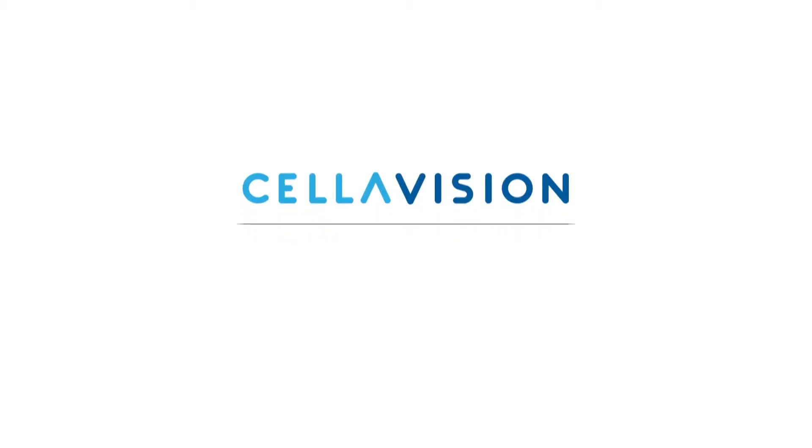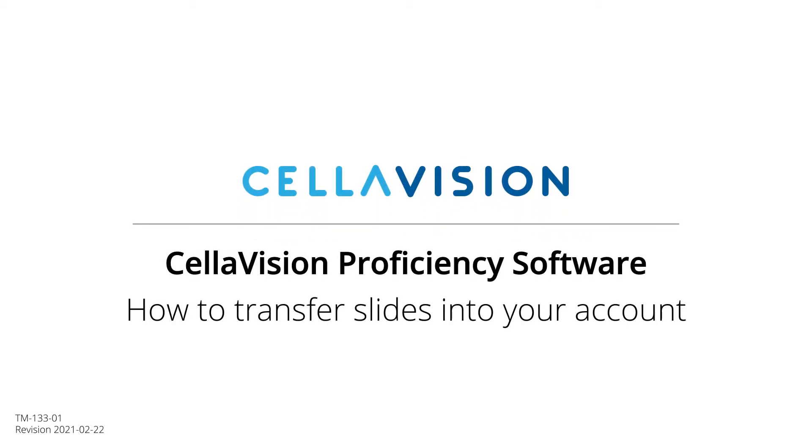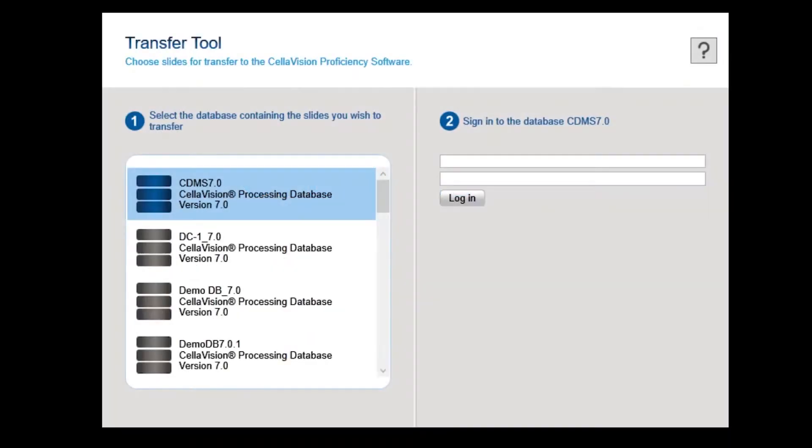Let's show you how to use the Transfer tool and transfer slides from your CellVision analyzer's database and upload them to your CellVision Proficiency software account.